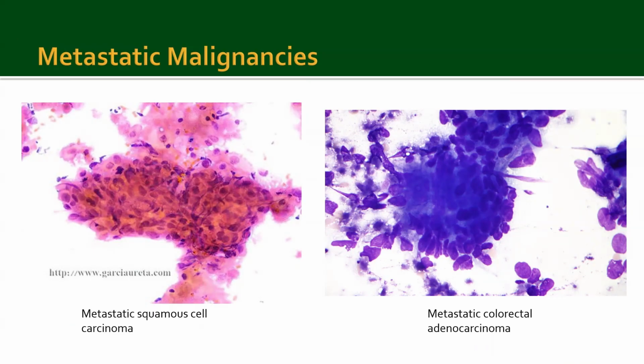So if I see something that looks like an adeno, I most often am going to suspect something that isn't a cholangio, so a metastatic adeno, but I wanted to include an image of an adeno just so you can see the similarities between a cholangio and something like a colorectal. I just want to say, beautiful elongated nuclei on the core picture. Yes, that is a very good colorectal adeno with those cigar nuclei.